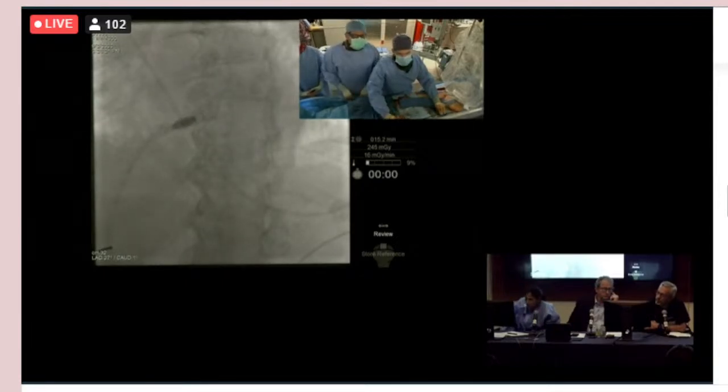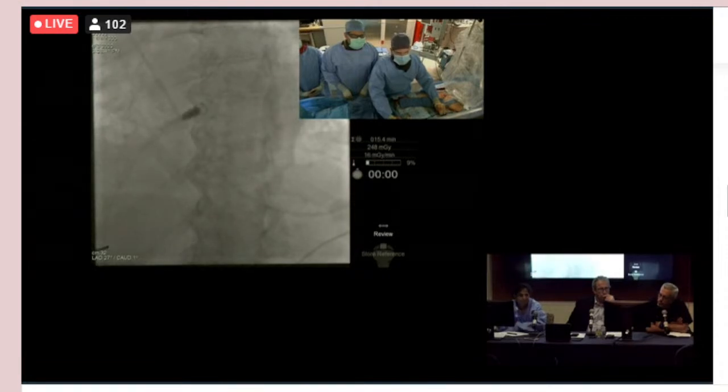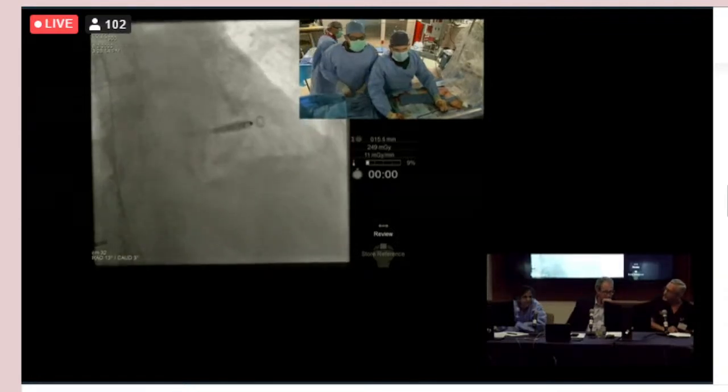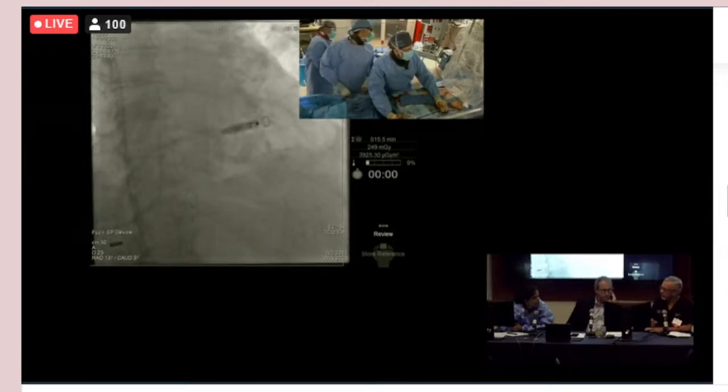So we're doing a clockwise torque. And you can start to see a goosenecking. How much gooseneck do you guys like with this? I don't like to push really hard on these ladies. RAO, please. I mean, I usually get a good gooseneck. Go LAO. I think the sheath is actually reasonably forgiving from that perspective. And the buckle on the sheath is actually not bad. It doesn't transmit pressure to the distal end. Yeah.